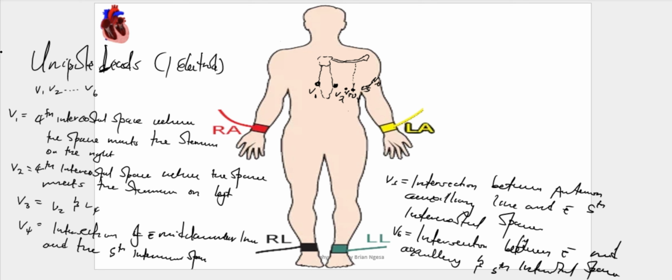So this is likely to give us again a lot of information specifically about the heart, in the ventricular area. So for example, how are you able to see these unipolar leads placed? If you are to take the cross-sectional surface, in a plane, let's have something like the spinal cord.